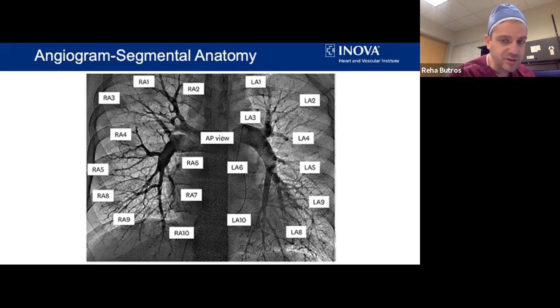And we do this in a gradual, staged fashion. We start with 2 millimeter balloons and go up to 4 to 6 millimeter balloons. So that's a lot of procedure time. And meanwhile, the patients are under only local sedation, and we have to control their breathing. Every case takes about 2 to 3 hours, but it requires a lot of patience, both from the operator standpoint and from the patient standpoint.